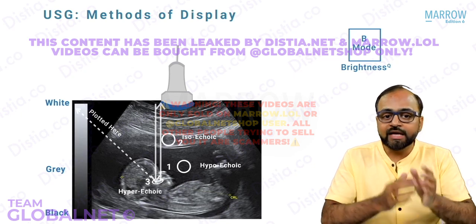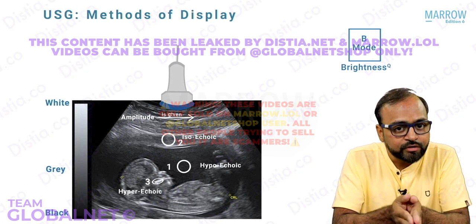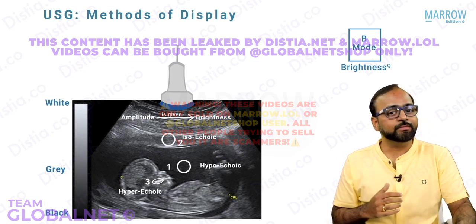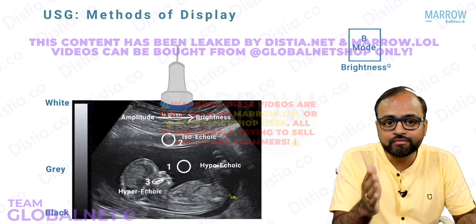So remember, the amplitude value of returning echoes at each and every point in this particular area is going to determine the brightness value of that particular point, and that is how a B mode image is created. Brightness mode, B mode image is a direct extension of A mode image.